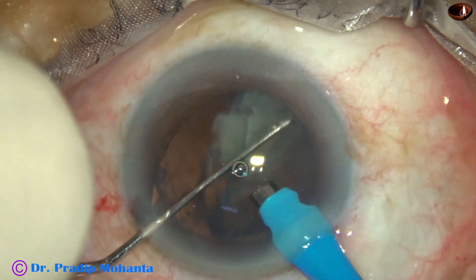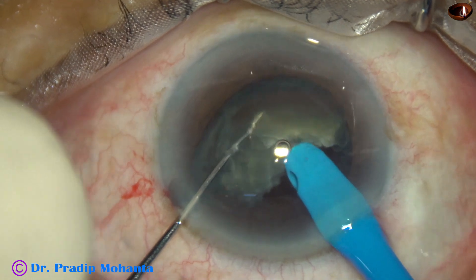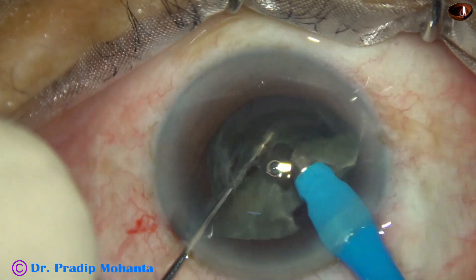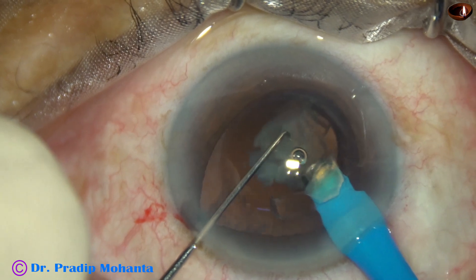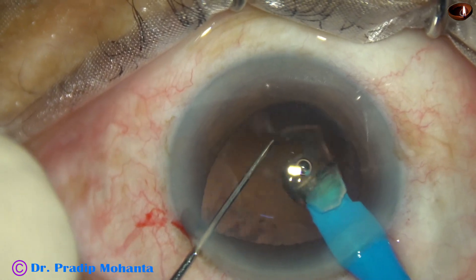Ultrasonic energy is set at 70%, but we can control what amount of ultrasonic energy is required by our foot, so we have to train our foot nicely. During emulsification of the last piece, I decrease the parameters — vacuum 350 and flow rate 35.